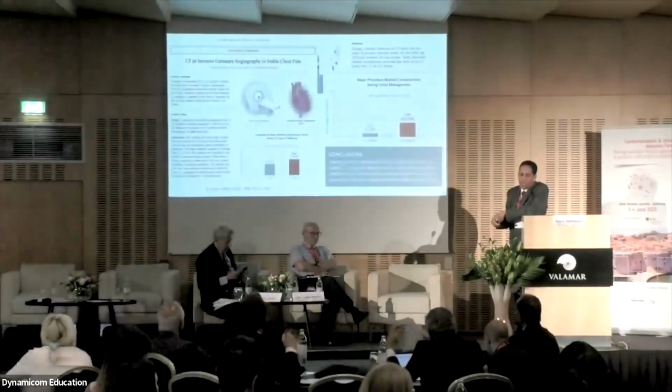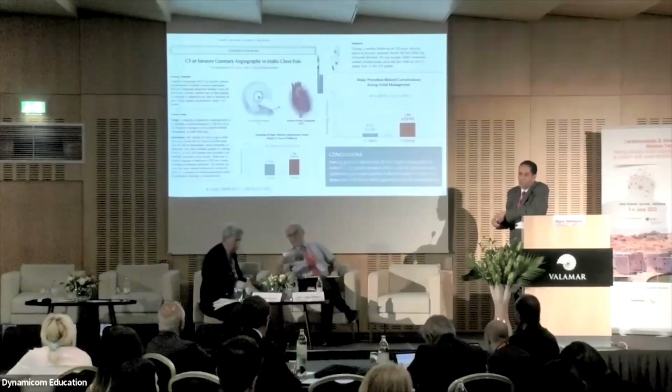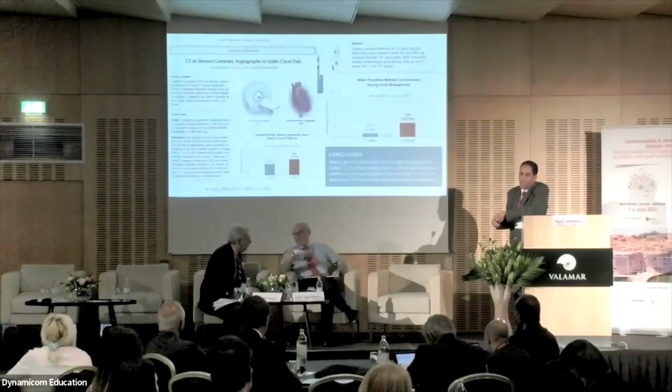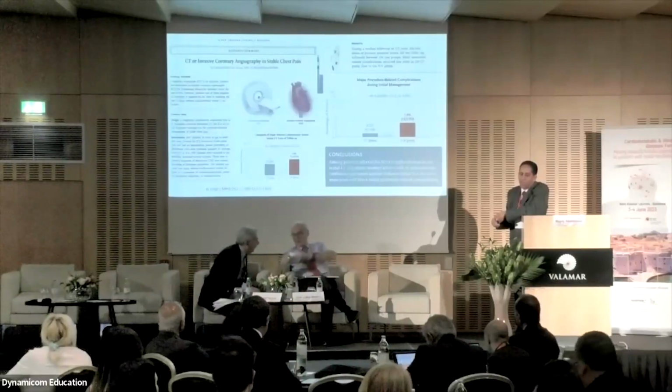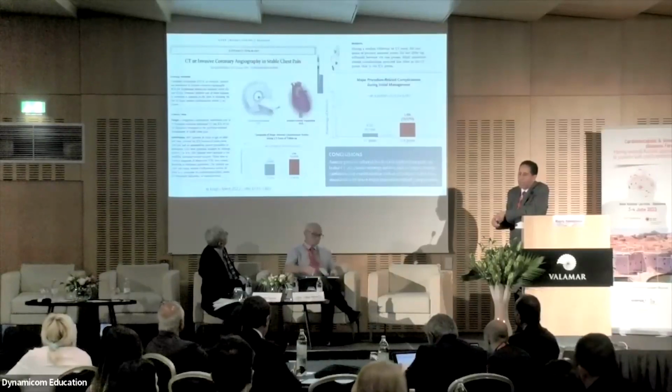This is an interesting study which was published 1 year ago, comparing CT coronary angiography with invasive coronary angiography in more than 3,600 patients. Is initial CT coronary angiography or invasive coronary angiography of importance for the outcome?